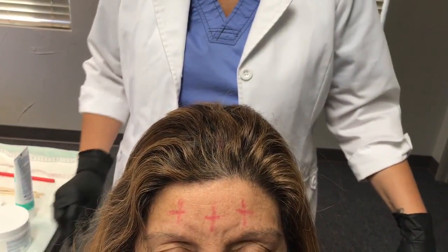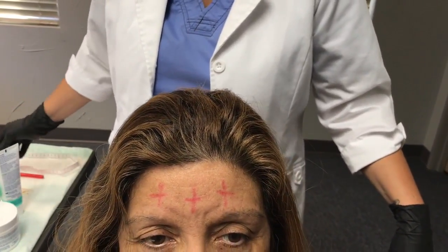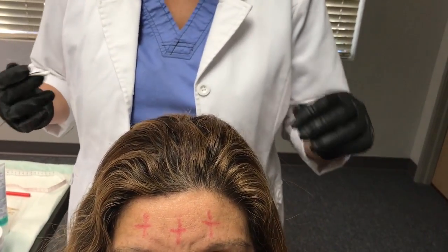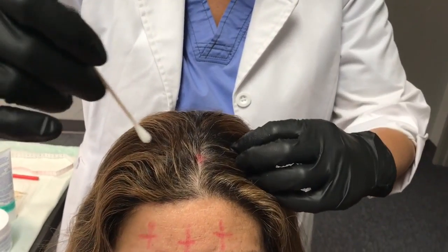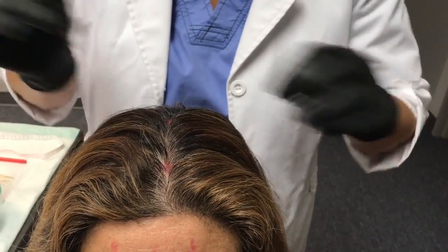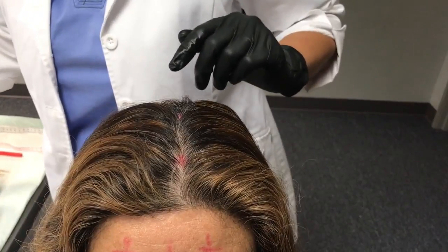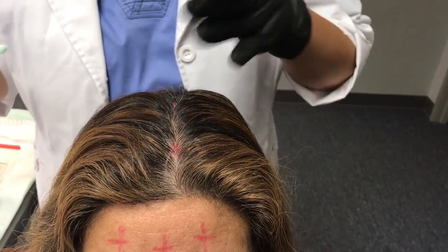Now that I've completed all measurements in accordance with the 10/20 International Placement System, I can proceed with EEG electrode application. Since electrodes must adhere to the scalp, you'll need to part the patient's hair so that the position marks of the electrodes can be seen easily. Next, you'll apply a small amount of NuPrep to a cotton swab and rub gently three to four times at the marked location.